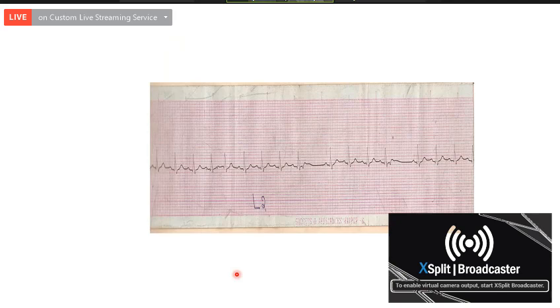There are two gaps. You should explain why there is a gap. What is the reason for a gap? Exit block. Yes, what block? Sinus exit block. No, it is not sinus exit block. No, wrong.